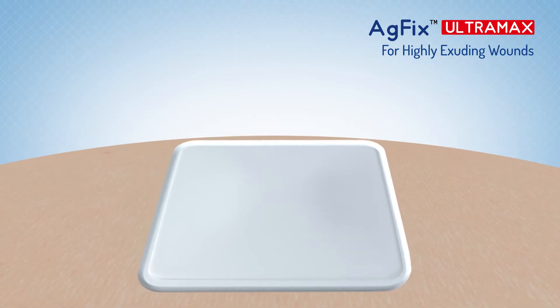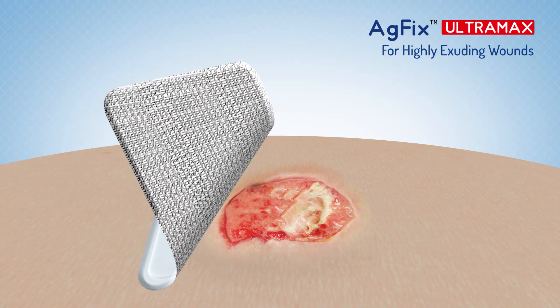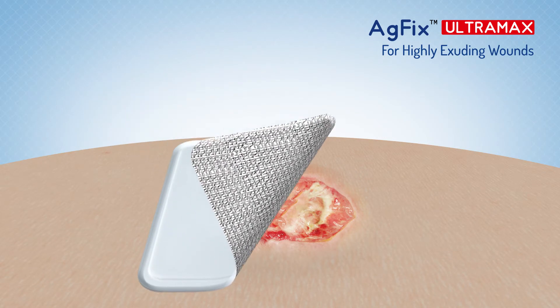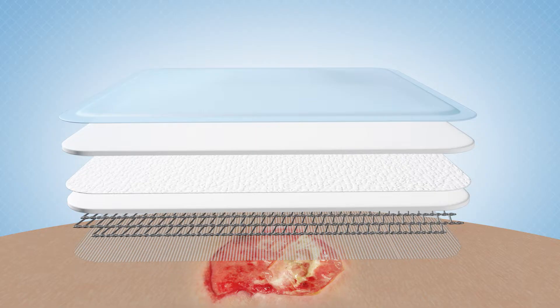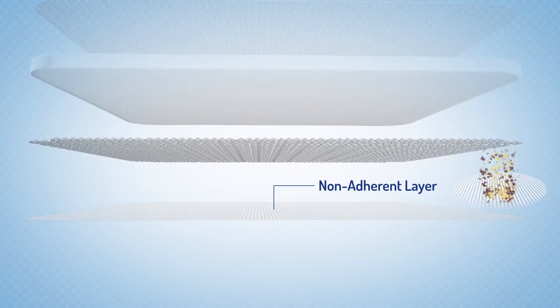AG Fix Ultra Max has a non-adherent perforated wound contact layer which reduces pain during dressing changes. The perforated wound contact layer allows exudates to pass through freely into the absorbent foam backing.